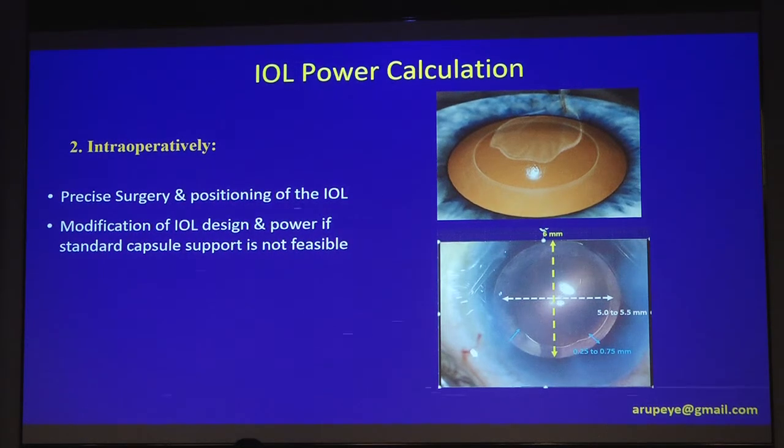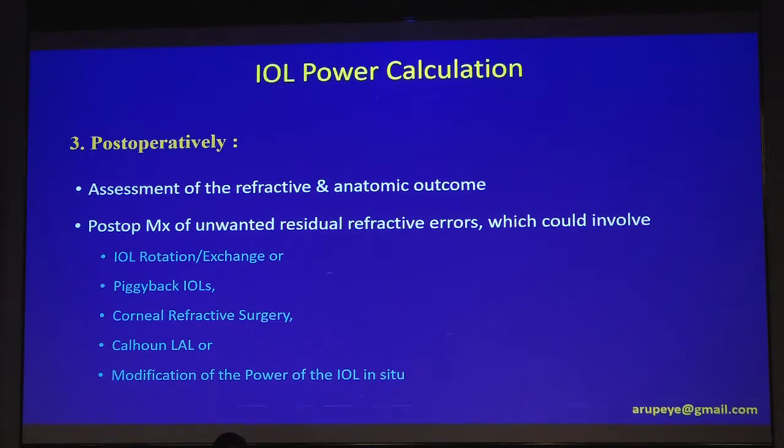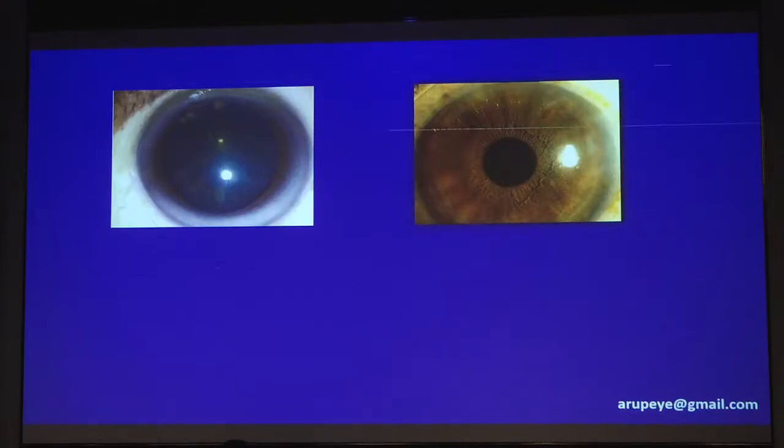You have to make sure that your surgery is standardized: temporal clear corneal incision 2.4 to 2.8 millimeter, central 5 millimeter capsulorhexis with anterior capsule overlapping the IOL optic surface. So we have to ensure this, as it reduces the error pertaining to the assumption of the effective lens position. This is the best we could do intraoperatively. Post-operatively is the moment of truth where you know how exactly you have performed, how far you're off from the target refraction, and then subsequently the lens constant adjustment may have to be done.